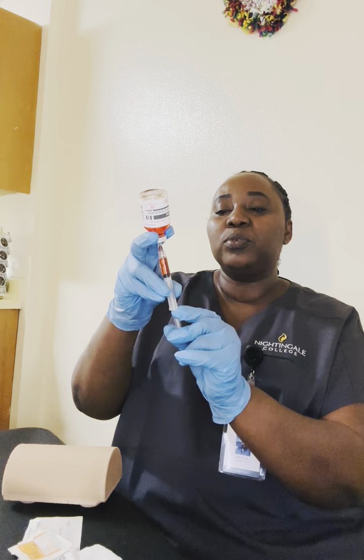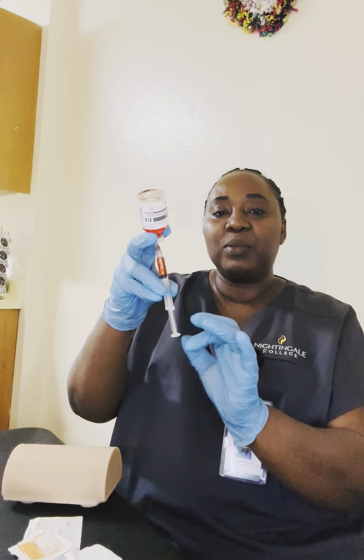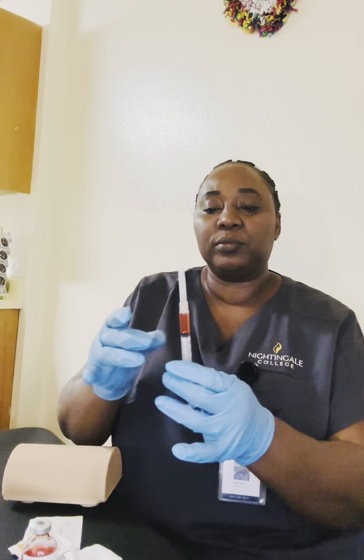If there are bubbles, I'll tap or flip at the bottom to push the bubbles out. Once that is done, gently take out the vial, recap with a one-hand scoop, and have 1.5 ml. At this point, I'm going to do my final check by going back to the EHR to do my six rights.